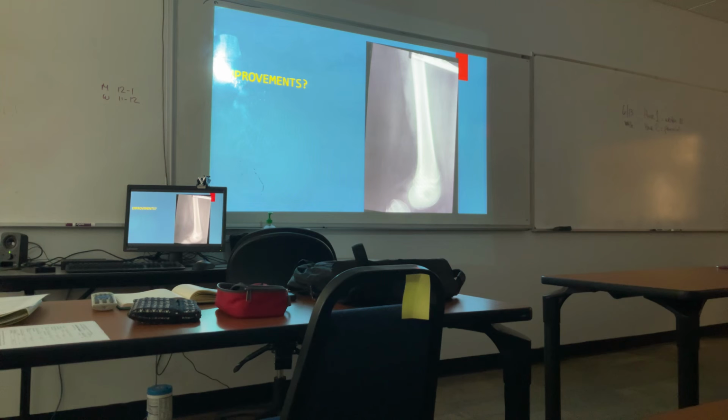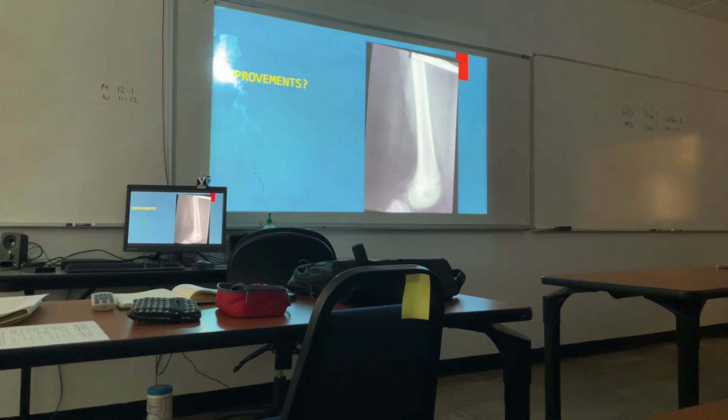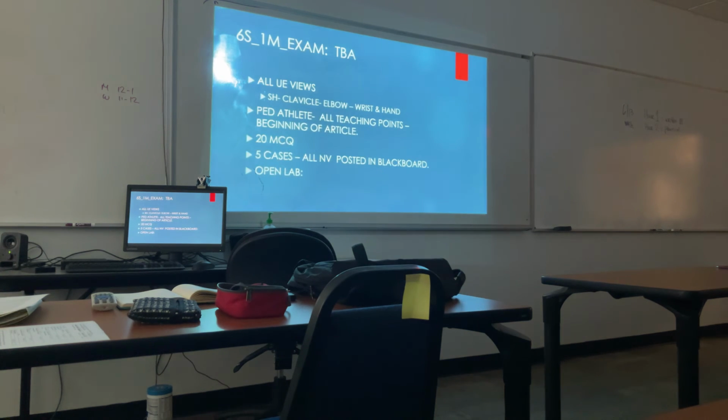There's radiolucency at the growth plate. We'll show you how to do a knee x-ray, but the point is the central ray should be at the tibial tuberosity, and you'll put the central ray at the same point on your lateral examination. You can't see it on the lateral because they didn't put the central ray there. It's too high. This doesn't help.